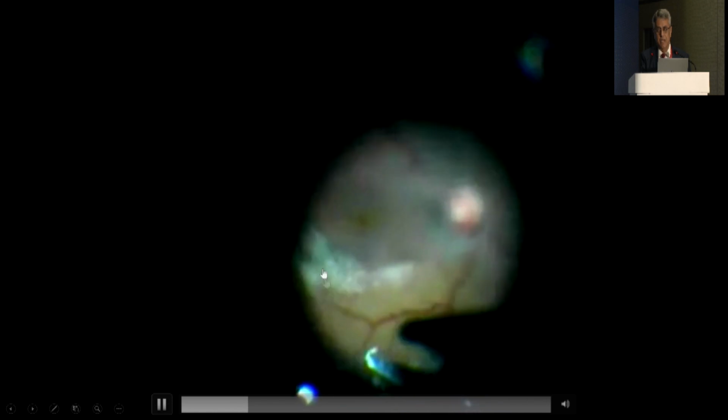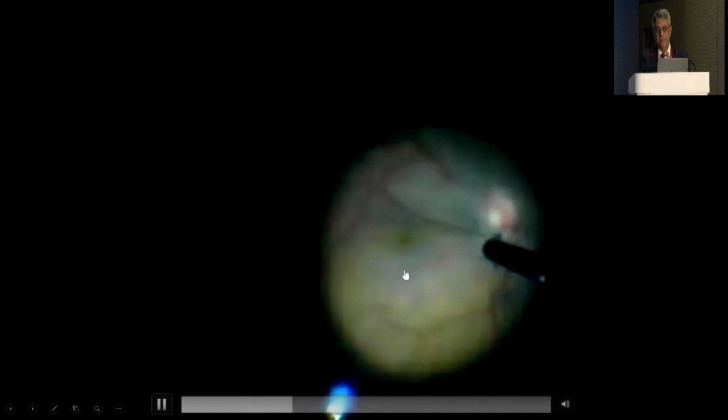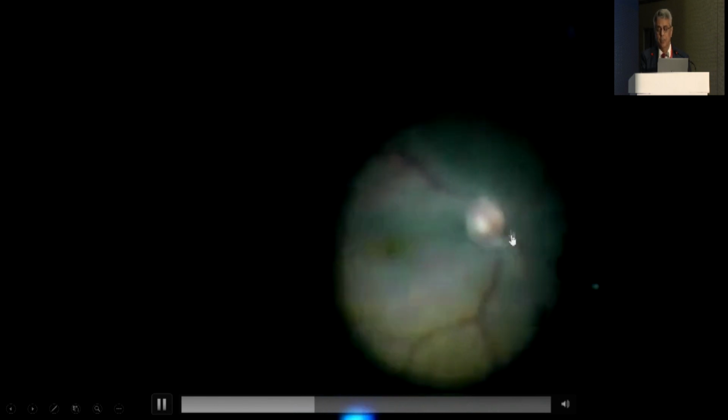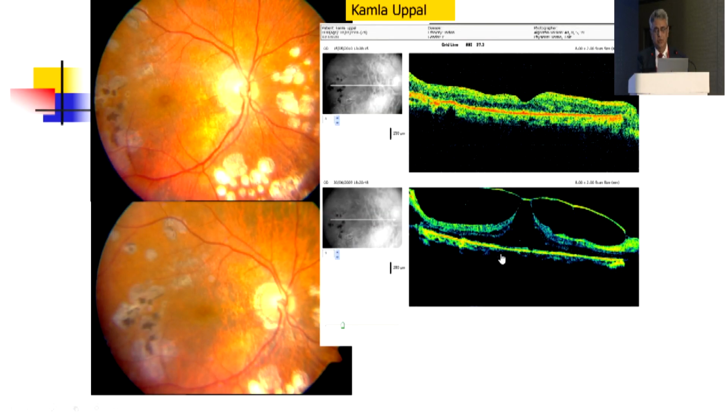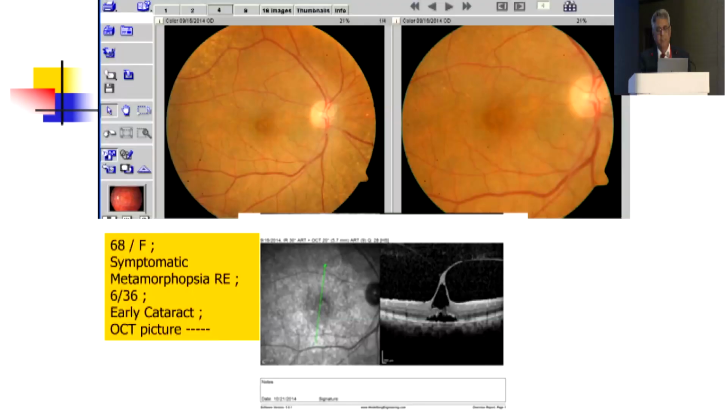In this patient, after doing a core vitrectomy, we put in triamcinolone undiluted, and I do not use that special preparation, we use normal triamcinolone only. With gradual increase in suction, with your eye always on the retinal surface, it comes out very easily. After that you do an air-fluid exchange, and results may take a couple of months, but the metamorphopsia disappears faster than the anatomical picture on the OCT.